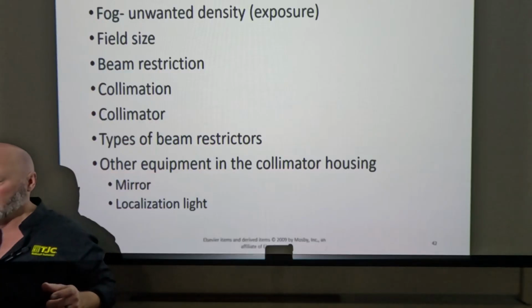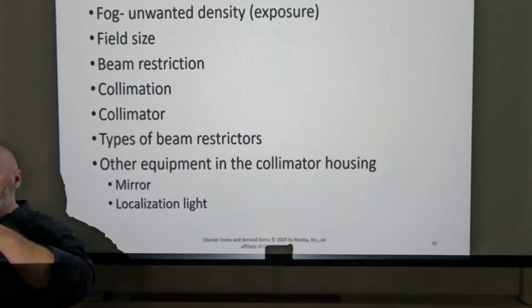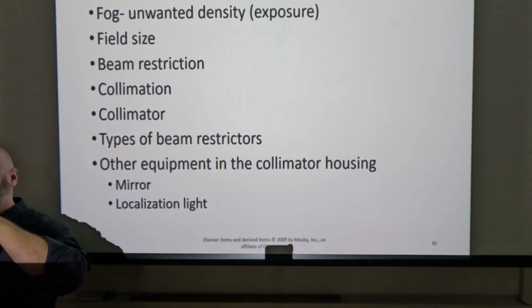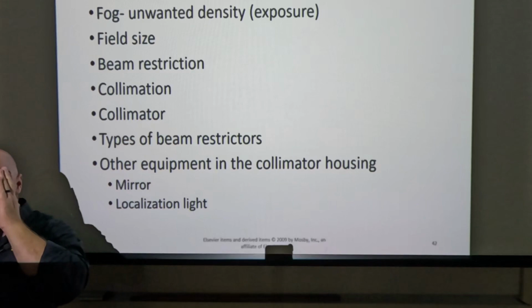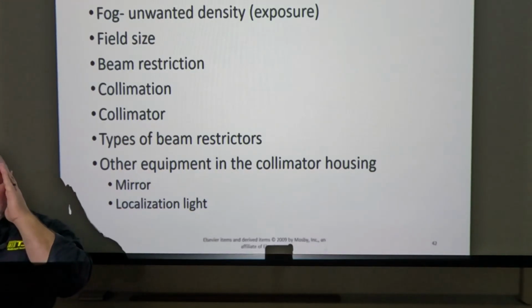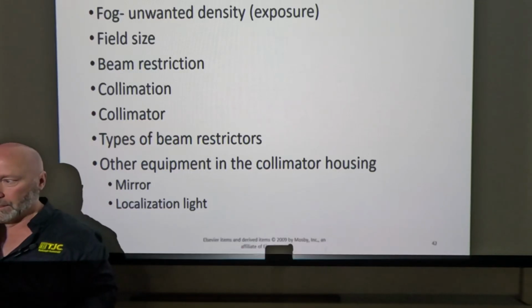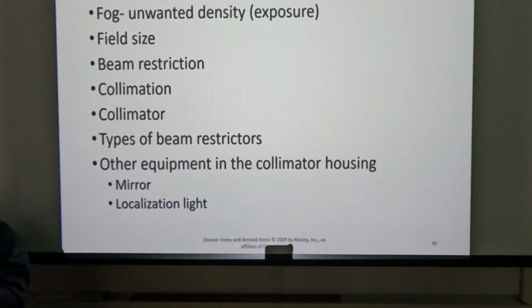There's a variance there, and again, we'll get into that later. But if it slips, it's going to become more horizontal, and your light field is going to go that way. So you line up to this patient's skull, since we're going through skull work, and they're in the light field, right? But on your image, the entire light field is shifted. So this is what you get. That's a good indication that your light field and your radiation field are misaligned. Okay, so perfect 45-degree angle.